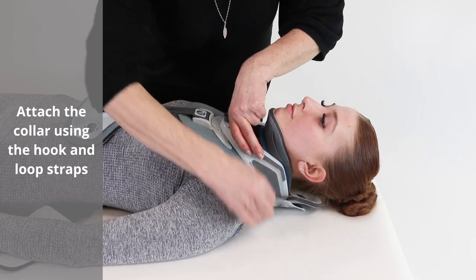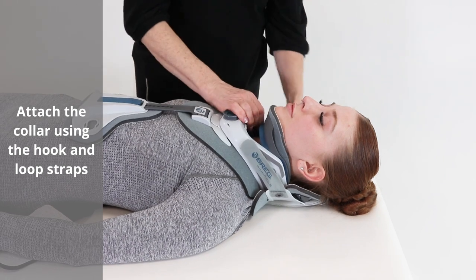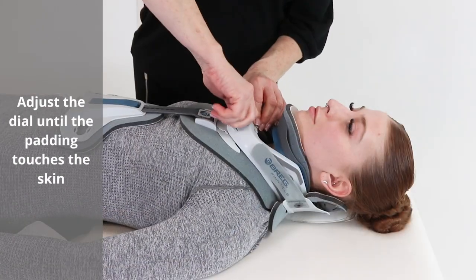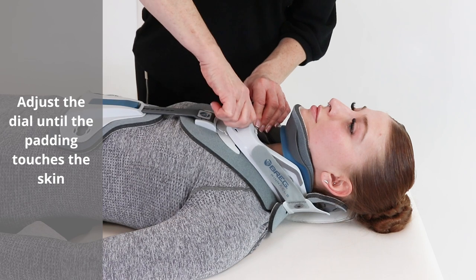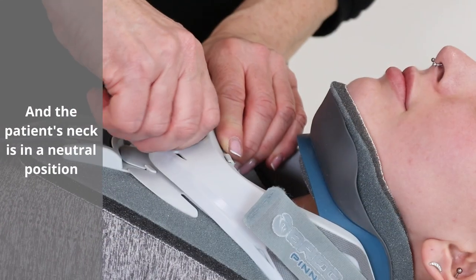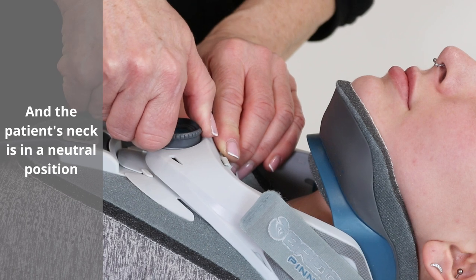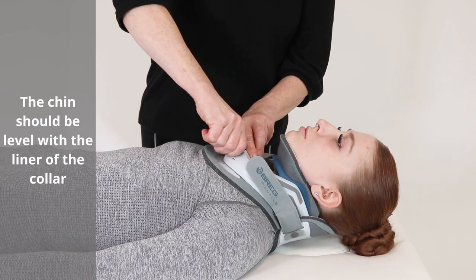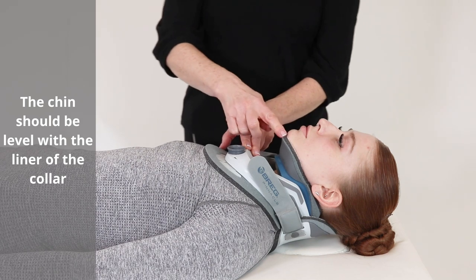Attach the collar using the hook and loop straps. Adjust the dial until the padding touches the skin and the patient's neck is in a neutral position. The chin should be level with the liner of the collar.